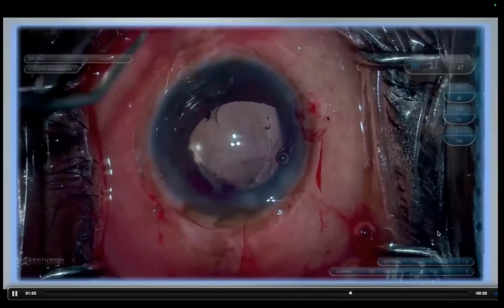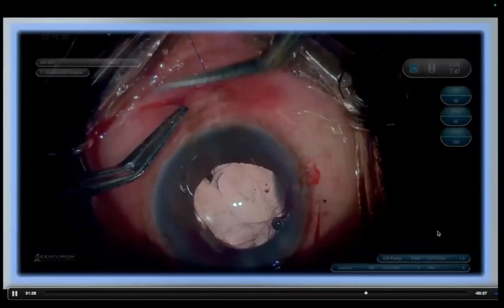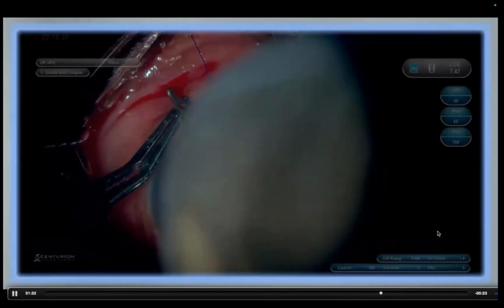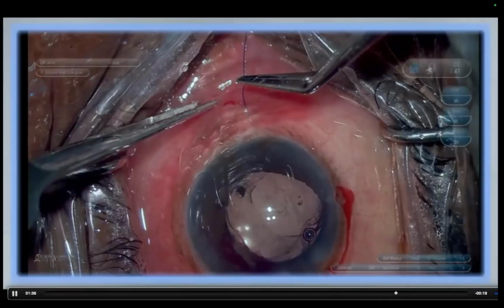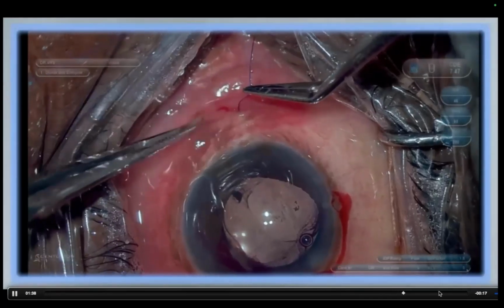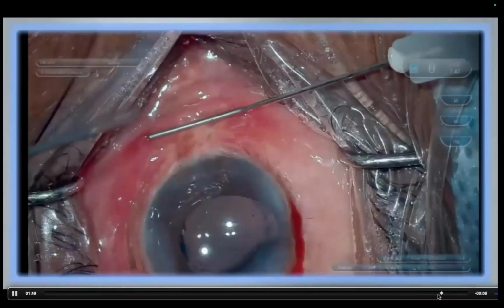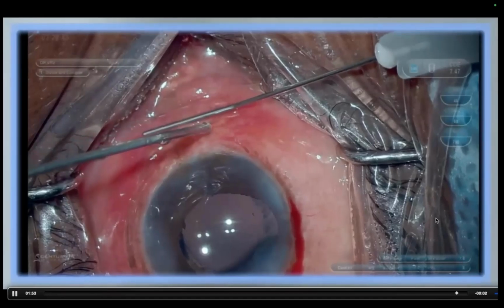All you have to do is pull the sutures coming out of the eye. When you pull that, until proper approximation is reached, you create a flange. You trim the suture to about a 1 mm flange, bury the first site, and then flange the second site. This is a little easier way of doing ID repair compared to the Hoffman's pocket. I was never a big fan of that.